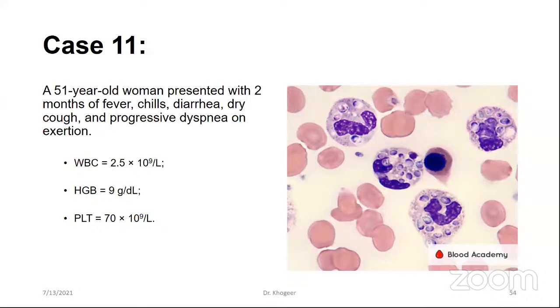Can you show Auer rods seen in mature cells? Yes. Be careful when you deal with APL. The main treatment for APL is ATRA, which makes these neoplastic or abnormal promyelocytes start to differentiate. So if you don't give another chemo to kill these cells, some of these cells, when they start to differentiate, can reach the stage of neutrophils, and there are still Auer rods.